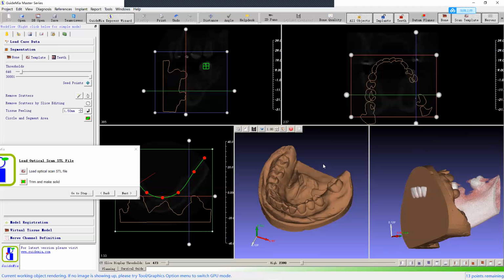Not greater than 0.5. 0.5 is the upper limit. Yeah, we cannot go lower than that. Even in the early days, people were doing that, but no. Do you think there are any machines that low? The new ones. Yeah, but typically, all the machines are now good enough.